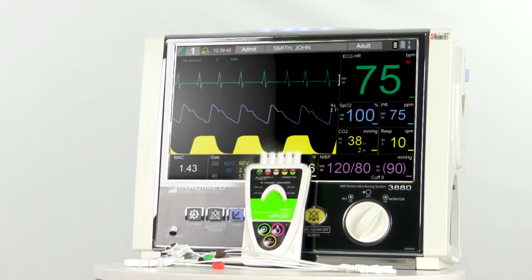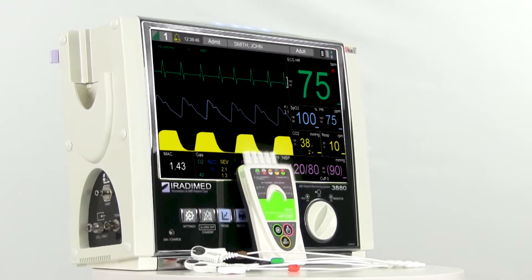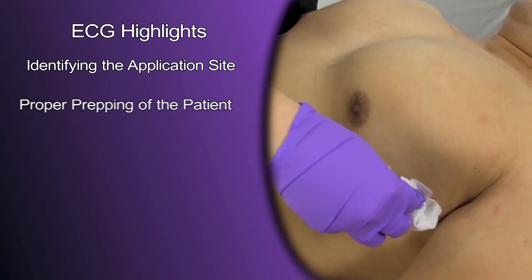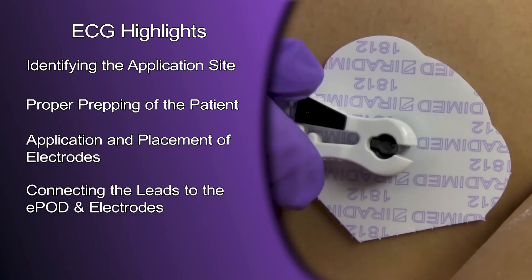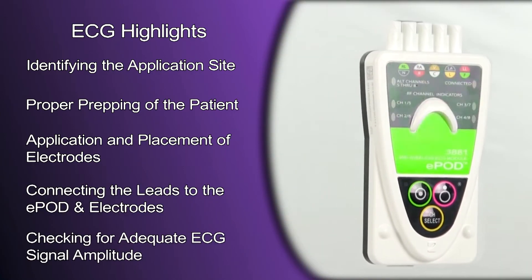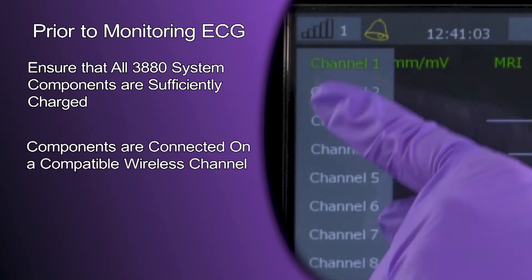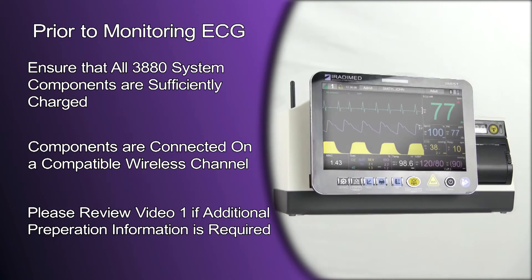In this video we are going to review the essential steps for preparation and application of the ECG Hextrode electrode pod and leads. We will focus on identifying the application site, proper prepping of the patient, application and placement of electrodes, connecting the lead to the pods and electrodes, and finally checking for adequate ECG signal amplitude. Prior to monitoring ECG, ensure that all 3880 system components are sufficiently charged and communicating on a compatible wireless channel. Please review video one if additional preparation information is required.